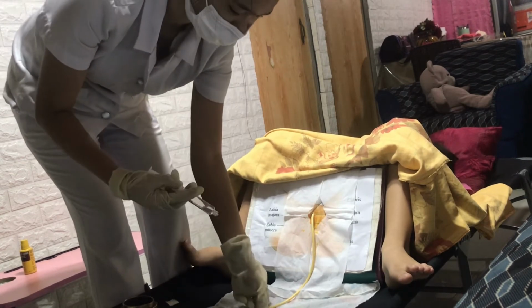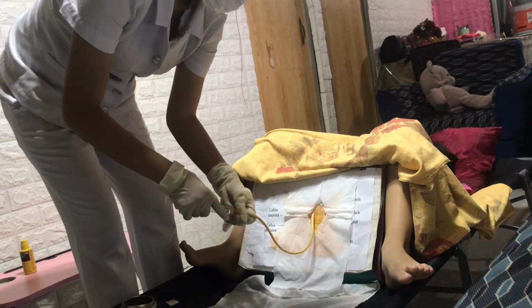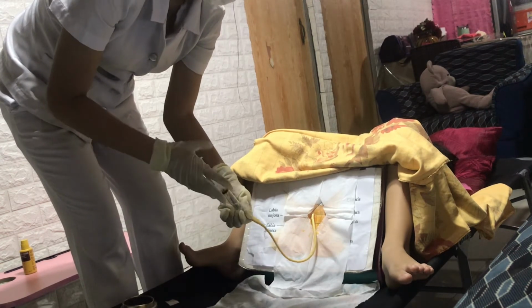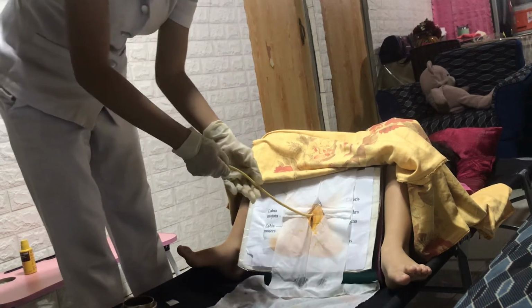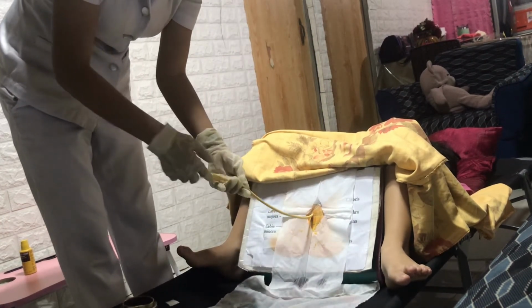Next, we need to test the resistance of the catheter by pulling it gently. The rationale for this is to check if it is anchored properly.